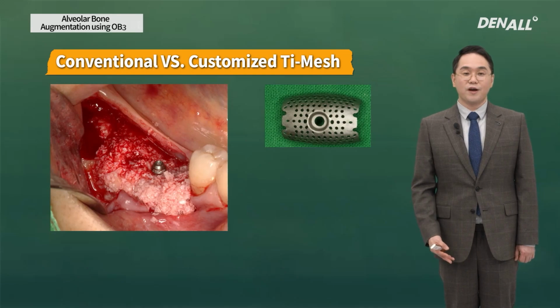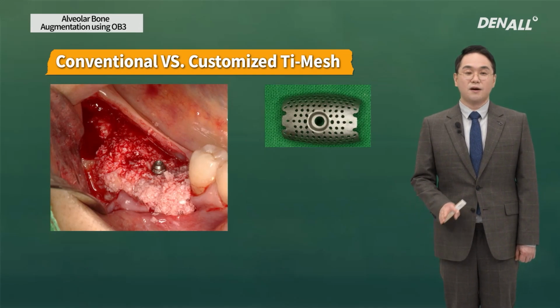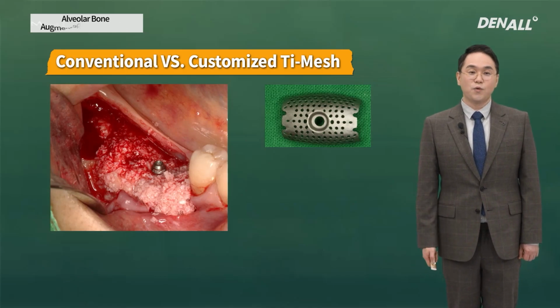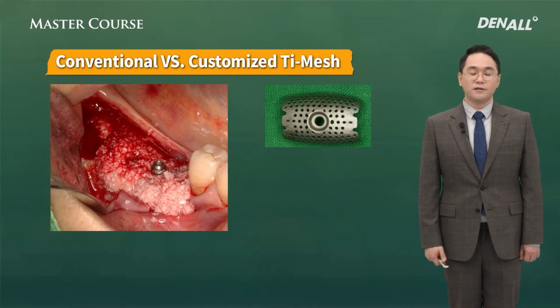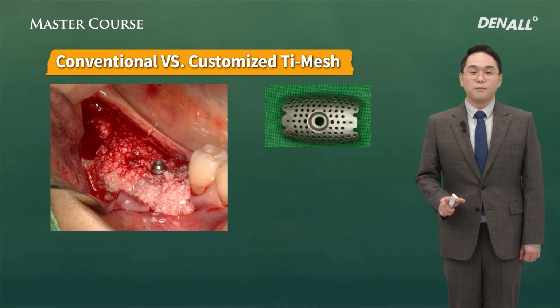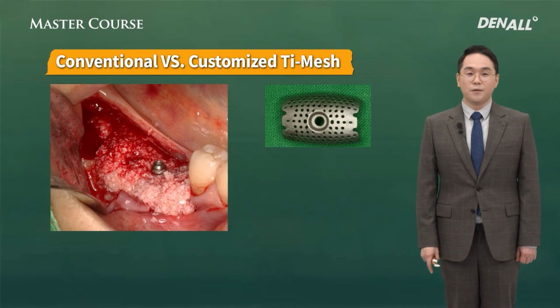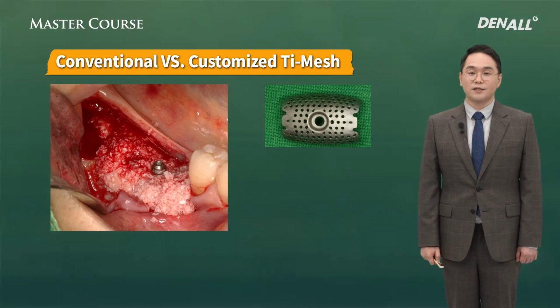So first the lingual flap is dissected and the site is covered with the bone graft material and the tenting screw is positioned. Autogenous bone and xenograft are mixed together. This is unlike the previous case. The vertical augmentation type Jawbuilder is used, which is 20 millimeters mesiodistally because the defect area is long mesiodistally.